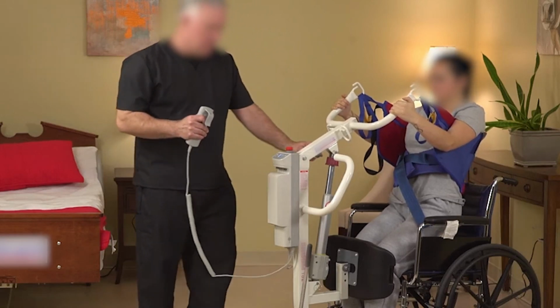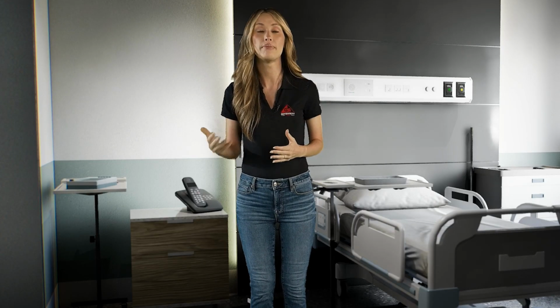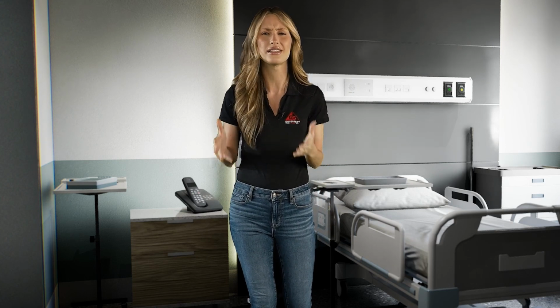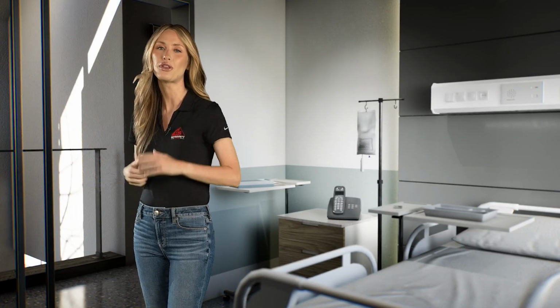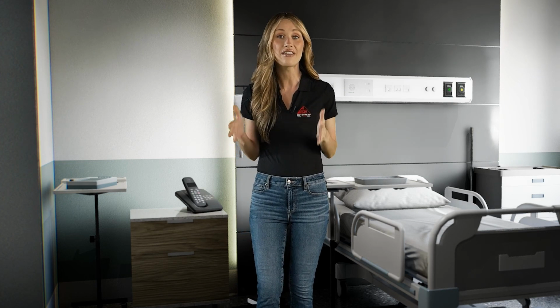We also have sit-to-stand lifts, which are essential for supporting patients as they move from sitting to standing positions. And for lateral movements, like moving a patient from a bed to a stretcher, there are air-assisted and mechanical lateral transfer devices, as well as friction-reducing devices that make the whole process a lot smoother. Transfer chairs are another crucial piece of equipment, especially for moving patients around more easily within facilities. All these tools are there to protect both you and the patient by minimizing the physical strain and risk of injury. If you want to dive deeper into this, we have a dedicated lesson on patient lift and sling safety that covers everything in detail.